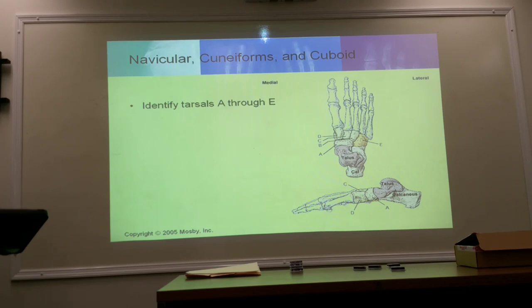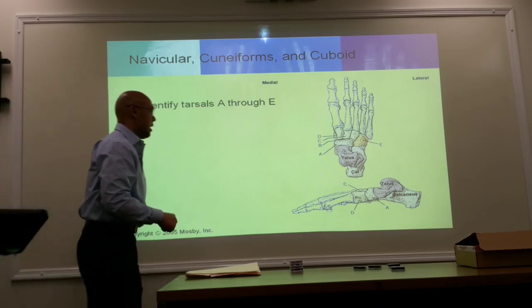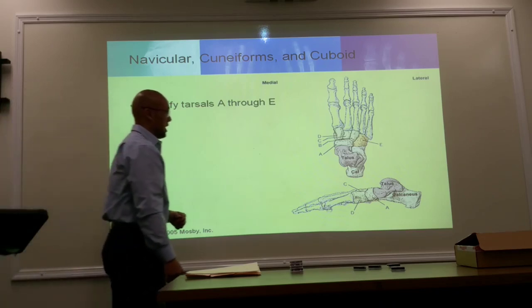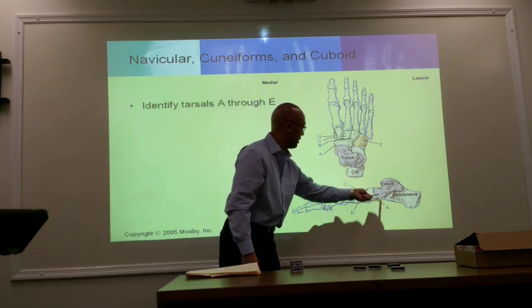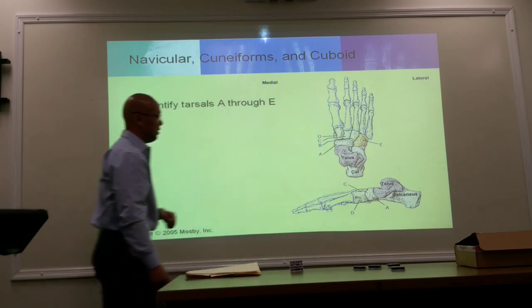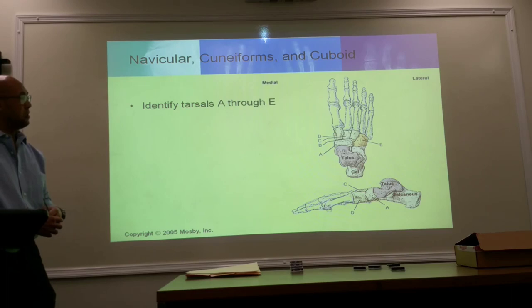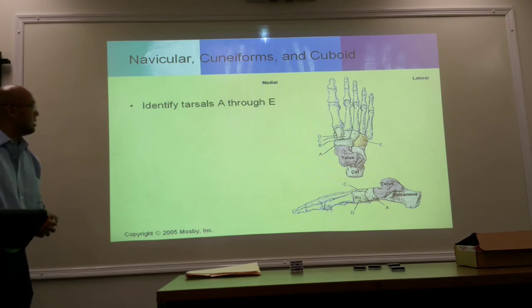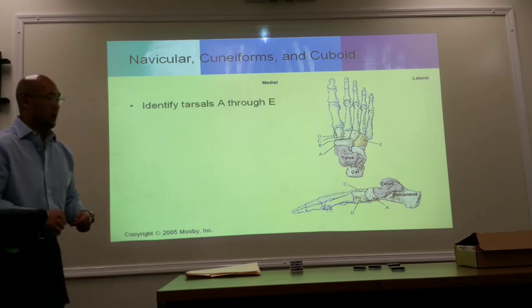So the bottom one here is the lateral of the foot. So right anterior to the talus, right anterior to the talus is what? The navicular. Navicular, and in front of the navicular is going to be your superimposed what? Cuneiforms. Okay. All right, so C and D are your cuneiforms that are superimposed. You can't see B, it's behind that. All right.